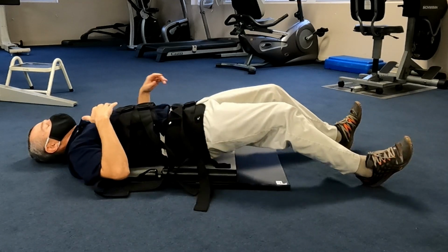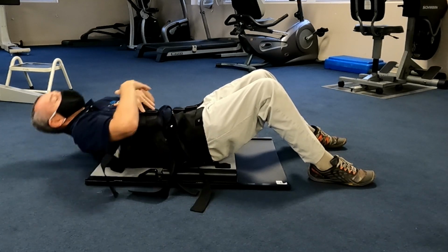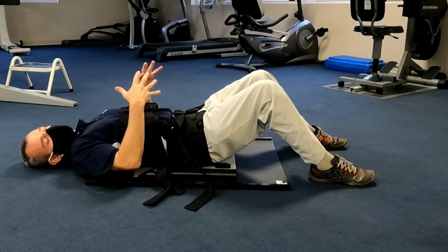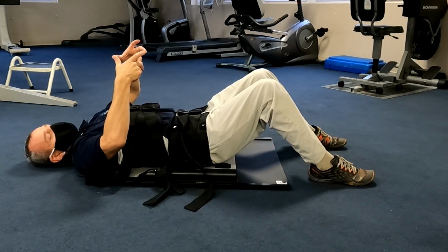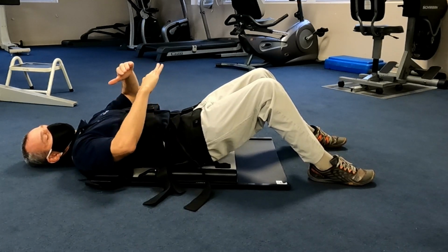And so you can kind of play. When I get into position, I adjust. I can tilt my pelvis. I can kind of sit up a little bit. I wiggle a little bit so that I'm relaxing pretty comfortably. Because some of us, based on anatomy, are going to have more of a tilt, less of a tilt. I like to do it with my knees flexed just a little bit, so I'm a little more posterior.